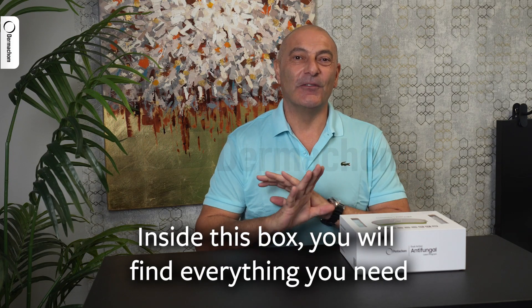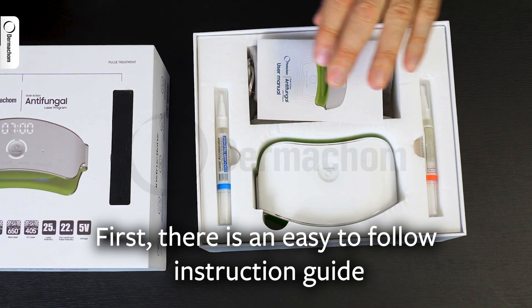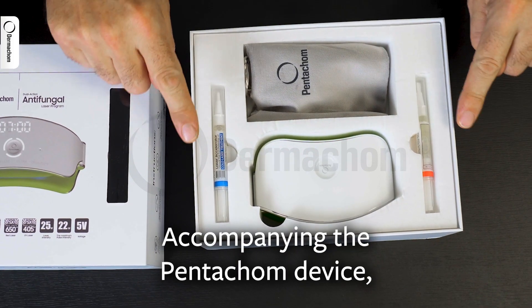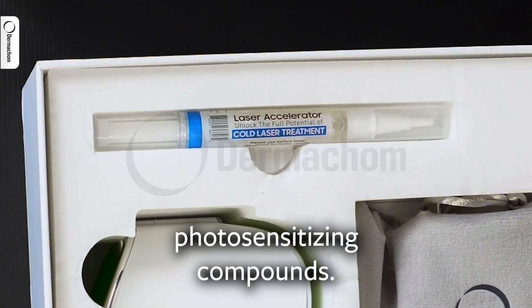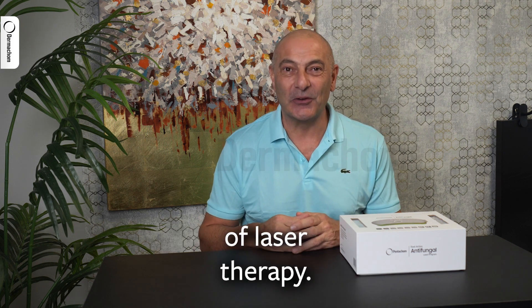Inside this box, you'll find everything you need for a revolutionary nail fungus treatment. First, there's an easy-to-follow instruction guide to ensure safe and effective use. Accompanying the Pentacom device, there are two treatment pens filled with potent photosensitizing compounds, specially designed to amplify the power of laser therapy.